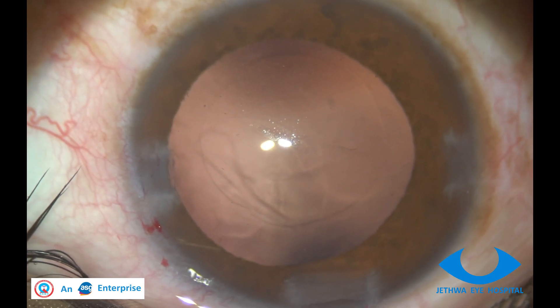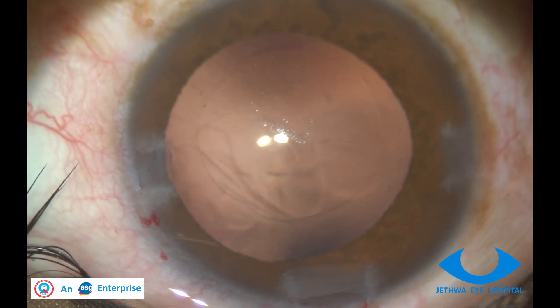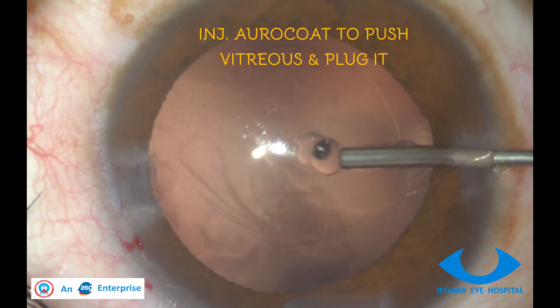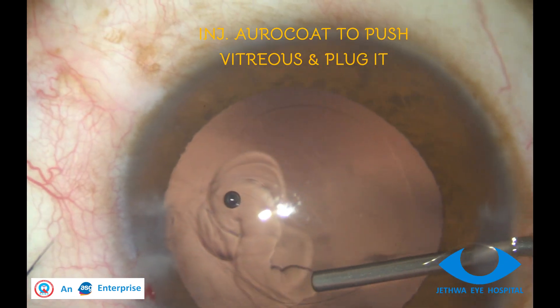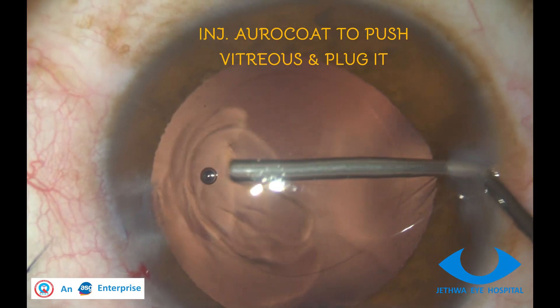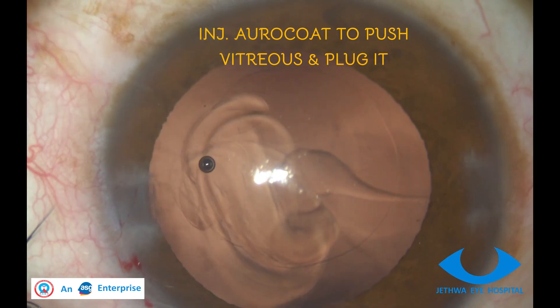Once it is swiped to the center, OVD is injected to push the vitreous into the posterior chamber and try to plug it.